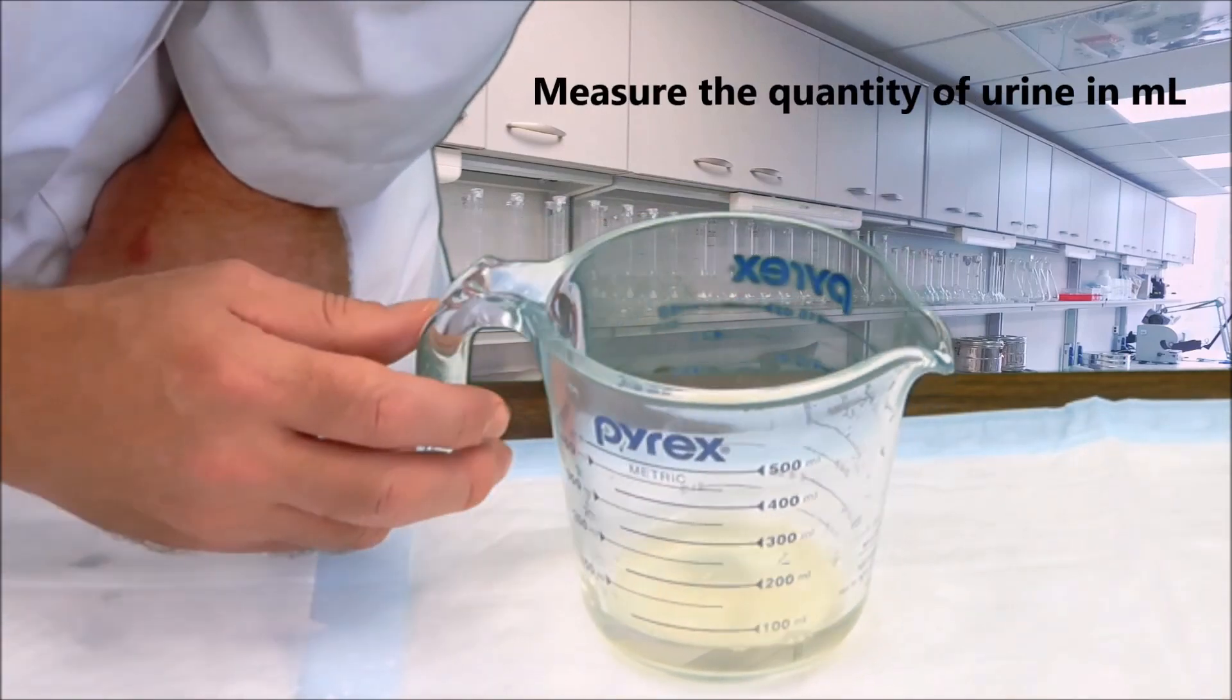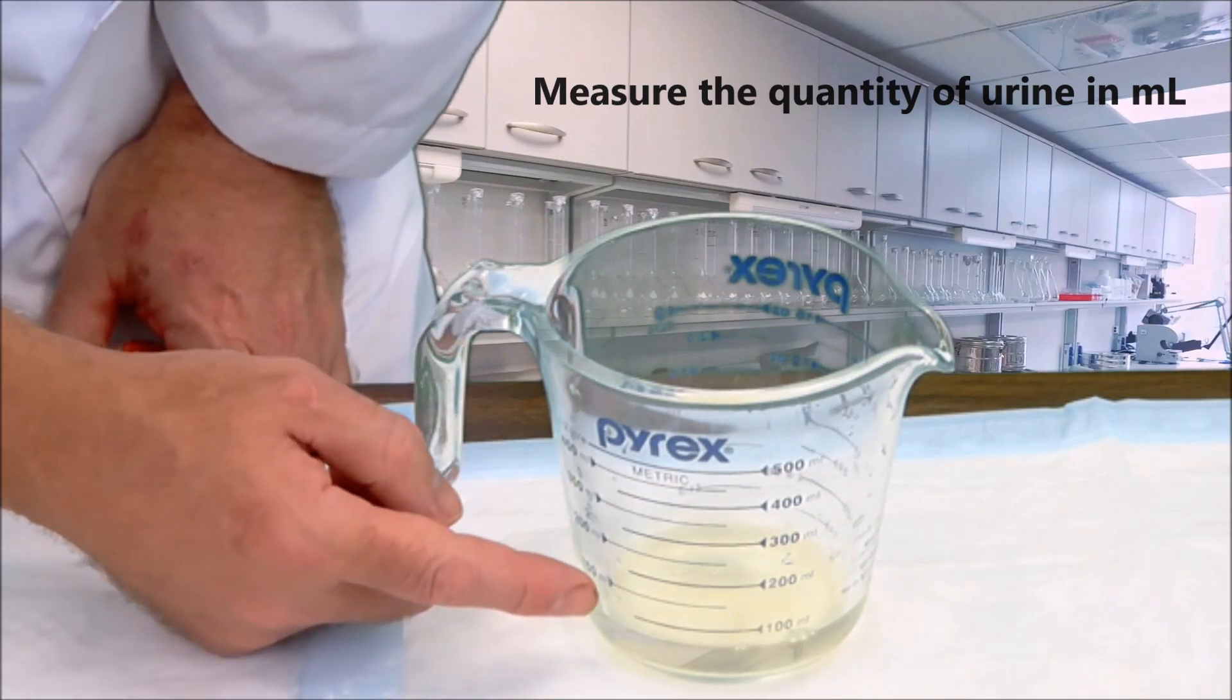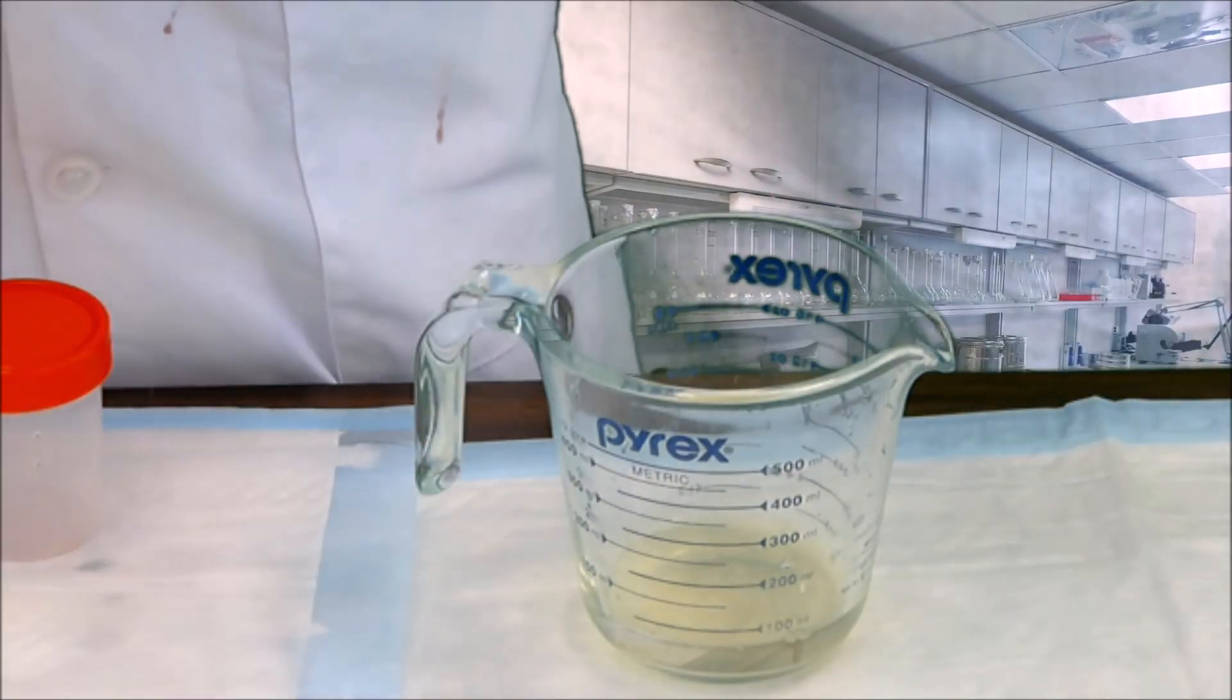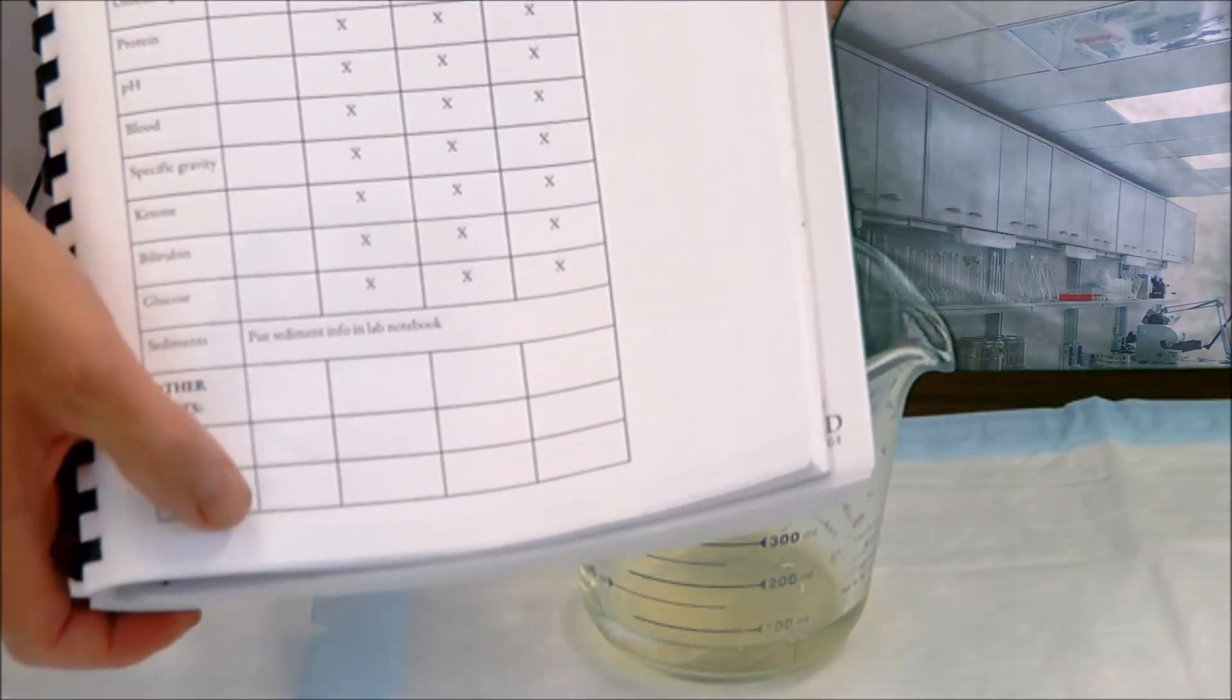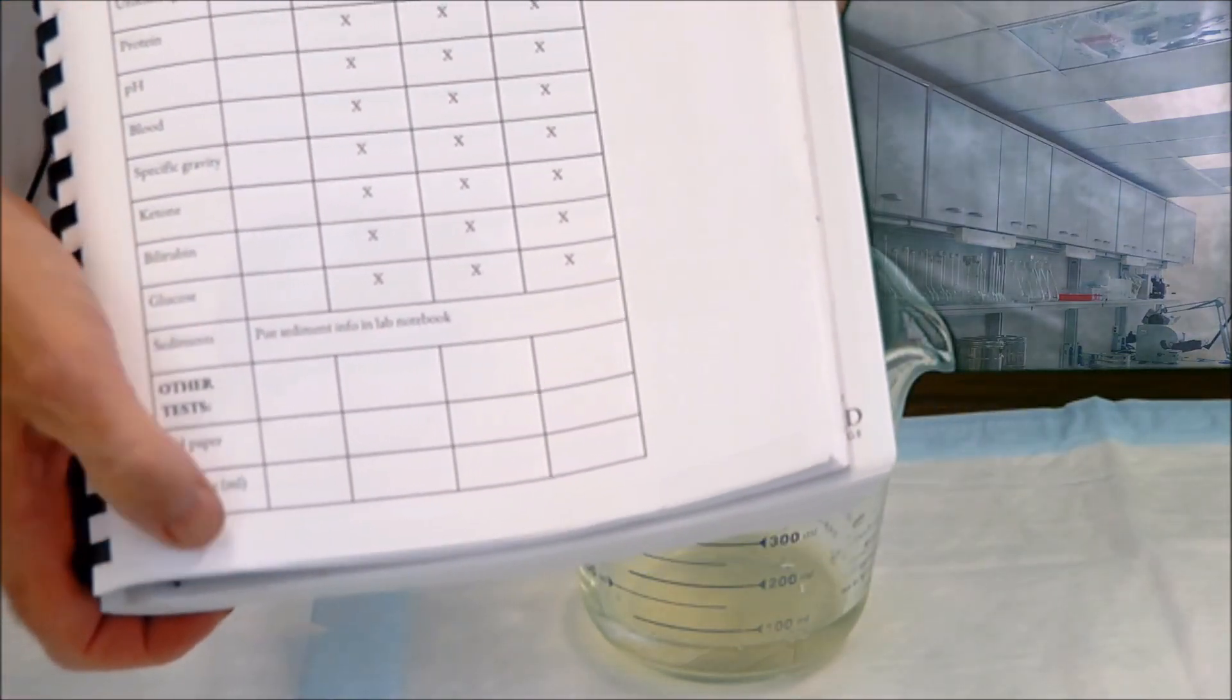So I can see it doesn't quite go up to the 100 mil line, so I'm going to guess it's about 70 or 80 mils. And I'm going to write that in my lab manual down here at time zero, the volume of urine that was urinated.